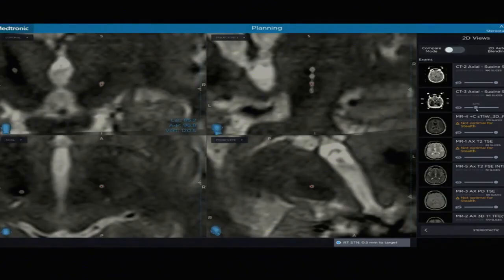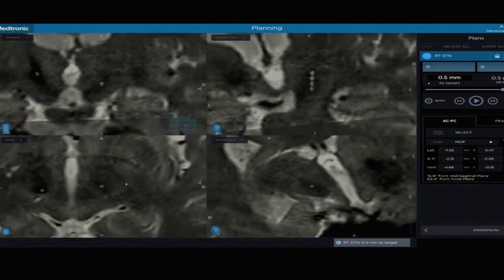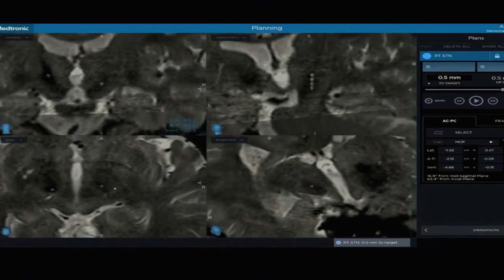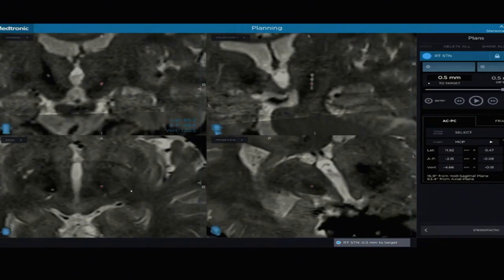And then relative to the surrounding structures, now we're turning on the MRI. We're right at the outer half. If you look at that subthalamic nucleus at a 45-degree angle, that looks just right. You can scroll up and down on that. Actually, use the arrows because the scroll goes 1 millimeter at a time.